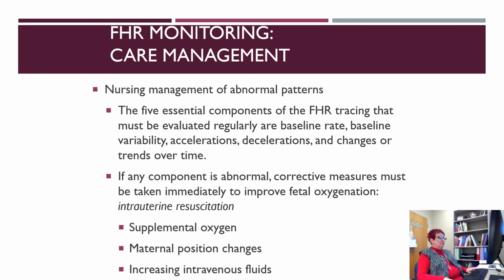So for care management of your patient, you need to watch the baseline rate, determine that, get a good tracing for about 5 to 10 minutes. Note any variability, if it's absent, minimal, moderate, or marked, any accelerations or decelerations, and anything like that. If anything is abnormal, you must do something to fix that. So supplemental oxygen, changing position, increasing IV fluids, getting extra help, whatever you need to do to have a good mama and a good baby outcome.